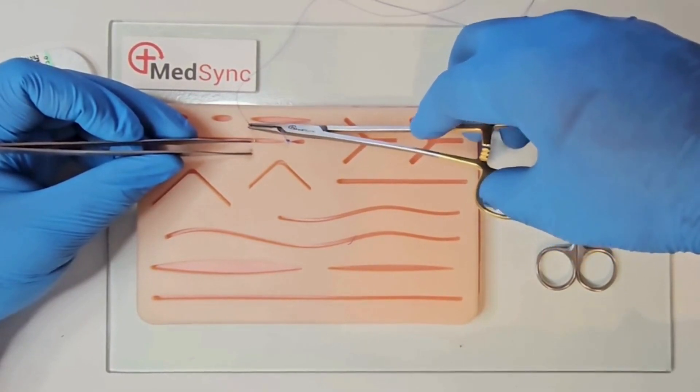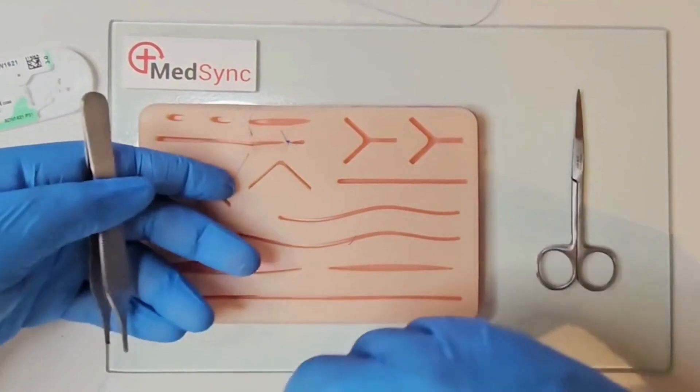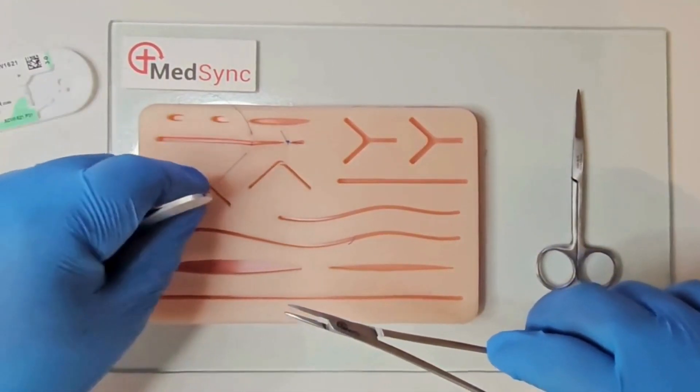Stabilize the needle with the forceps. Retrieve the needle out of the skin with the needle holder. With your left hand, pull the suture through.